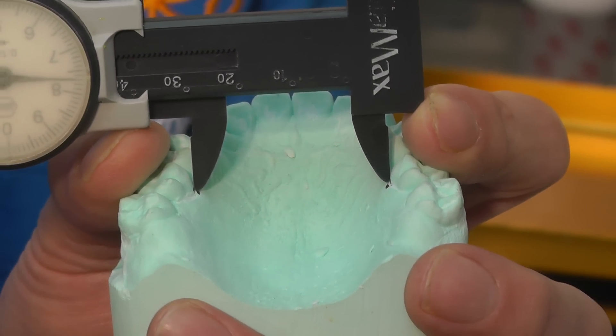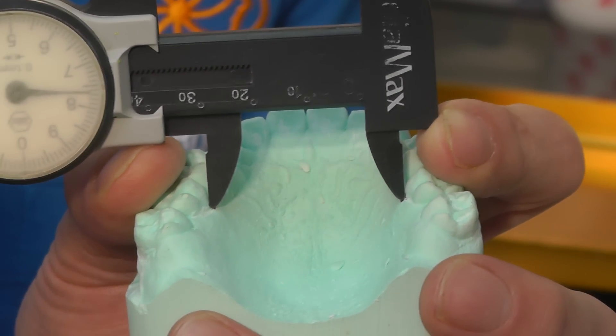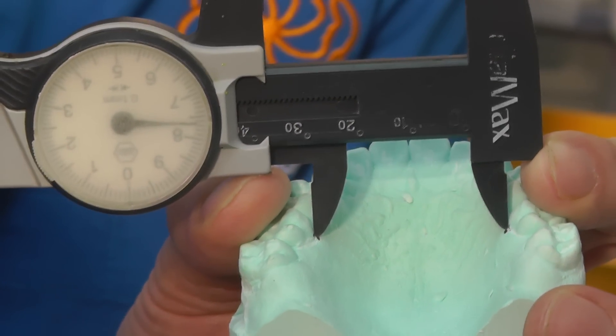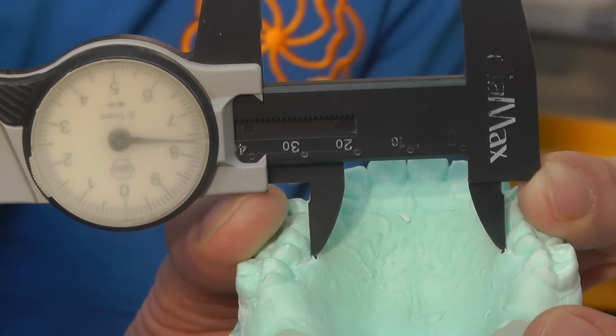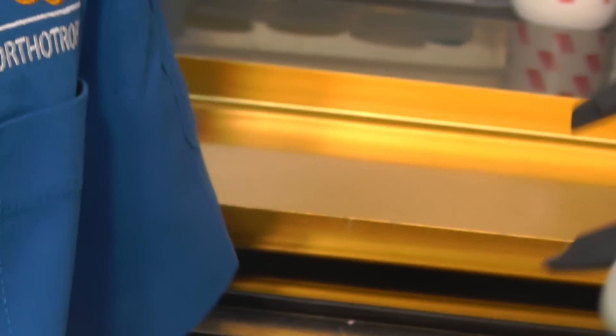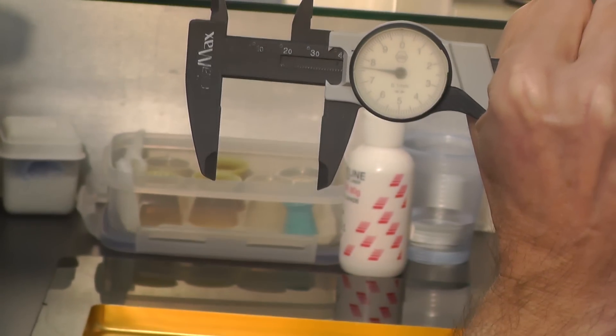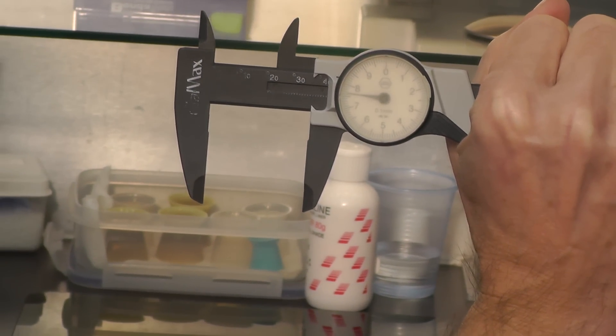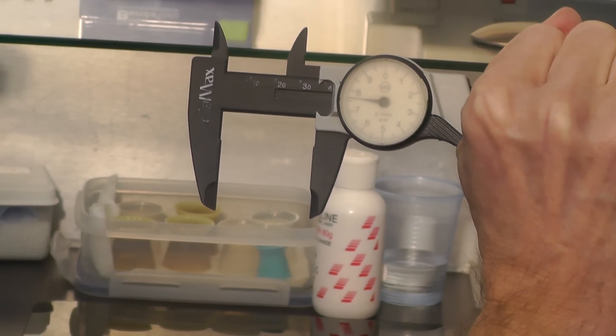You can measure quite accurately. I'm impressed with the reproducibility of this method. This patient has an intermolar width of 37.7.